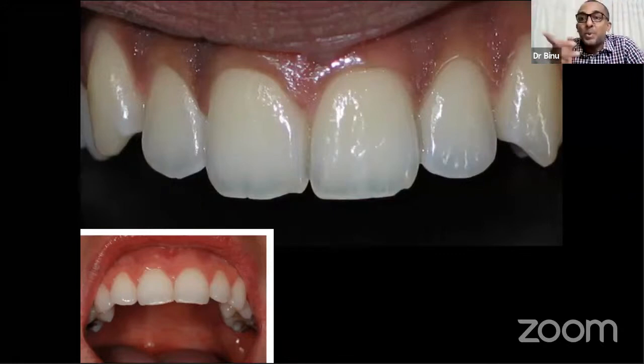Black chart paper. Those with kids here will understand, there'll be black chart paper at home. Just cut it into this shape and use it. This particular picture is taken with a black chart paper. But I have a contraster, which is around 500 rupees. That's all. I'm not costly. I'm telling you again, all simple stuff. It's attitude. It's attitude.